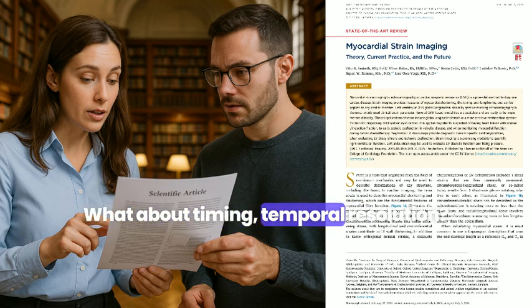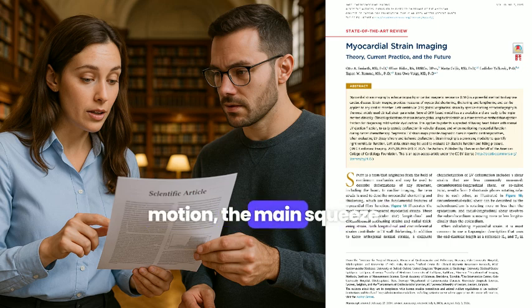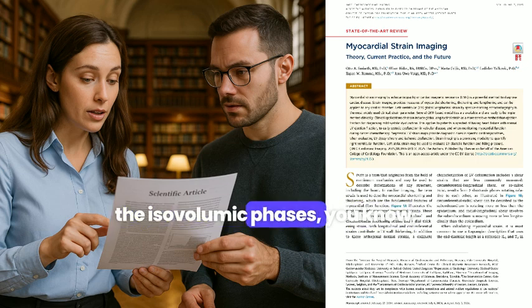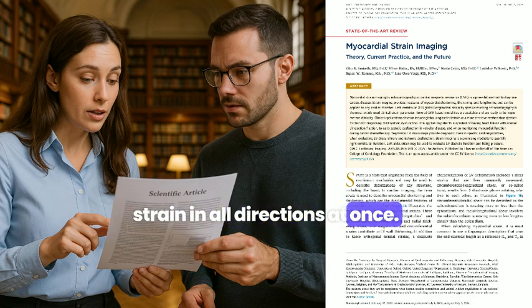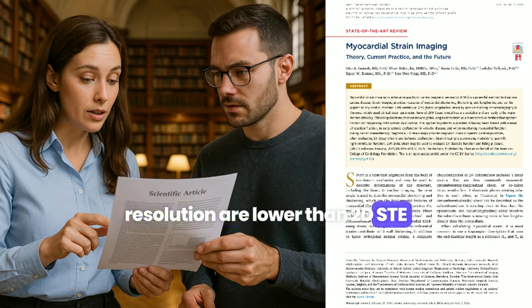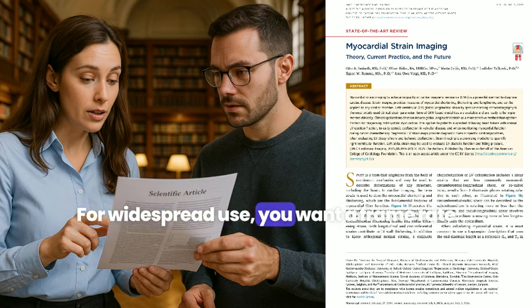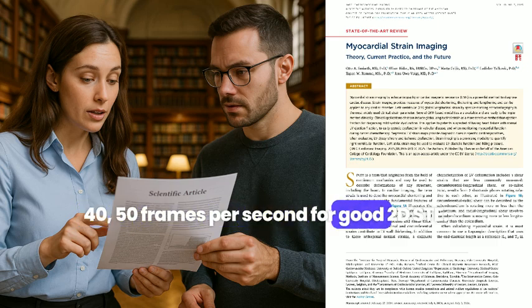What about timing? Temporal resolution. STE is generally fine for systolic motion, the main squeeze, but maybe not quite fast enough for really rapid events, like during the isovolumic phases, just before ejection or just after. And 3D STE? Theoretically, great, strain in all directions at once, but practically, the spatial and temporal resolution are lower than 2D STE right now, so it hasn't quite caught on for widespread use. You want a frame rate of at least, say, 40-50 frames per second for good 2D STE.